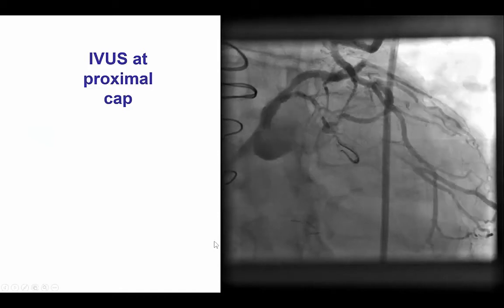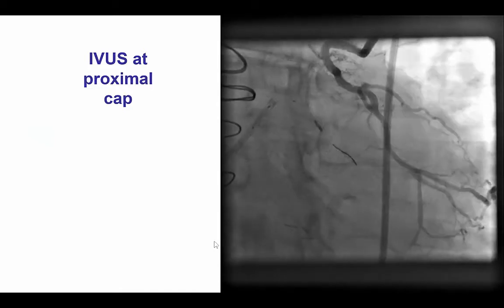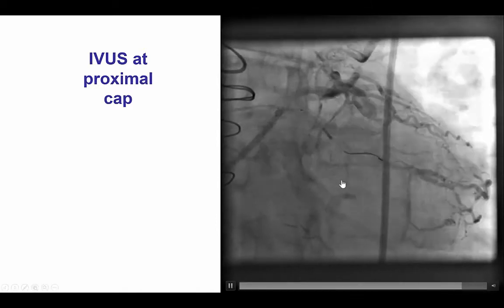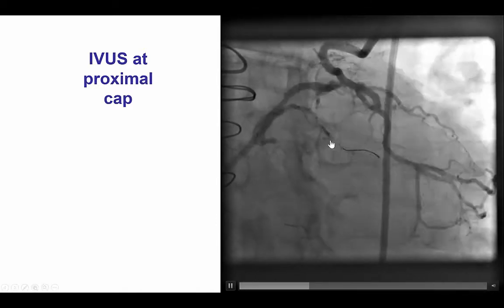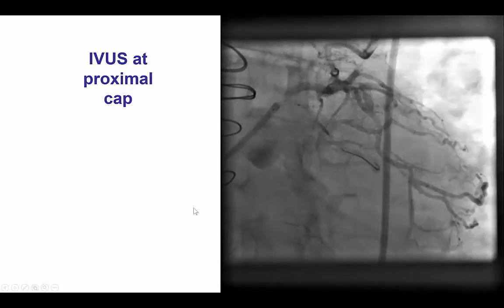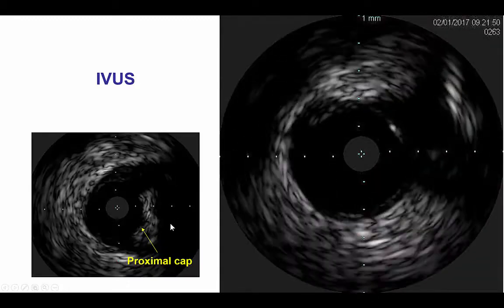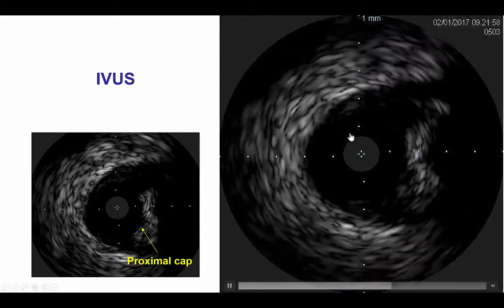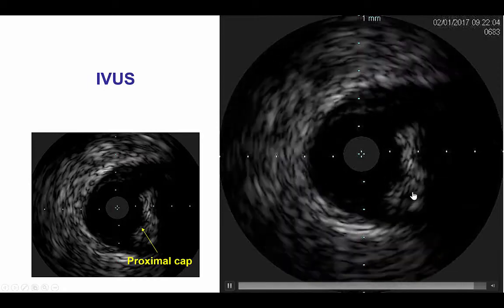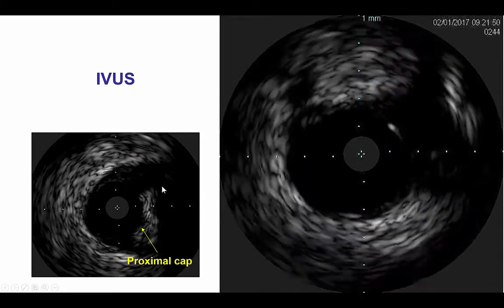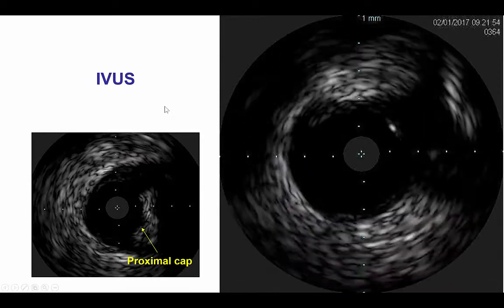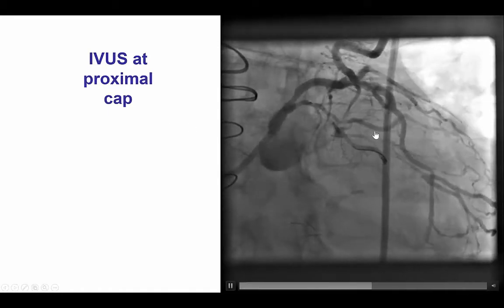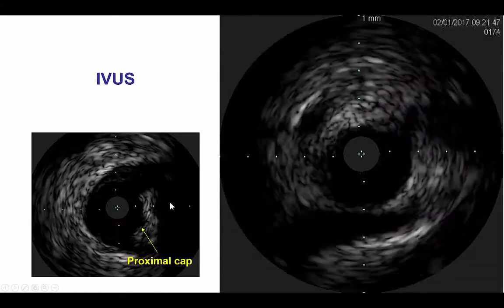We did several projections and tried to resolve the ambiguity of the proximal CAP, but this was fairly challenging. We advanced the guide wire into the large atrial branch, brought the intravascular ultrasound down, trying to understand where the occlusion started. This was challenging even with intravascular ultrasound. This is the large part of the vessel, and this seems to be close to the proximal CAP. However, it is unclear the relationship of this proximal CAP with the vessel proximal, especially this first obtuse marginal branch.